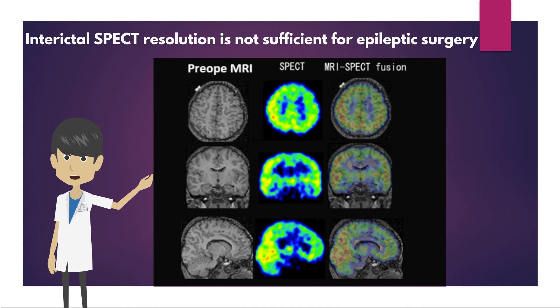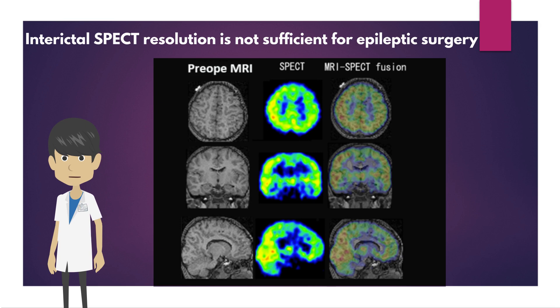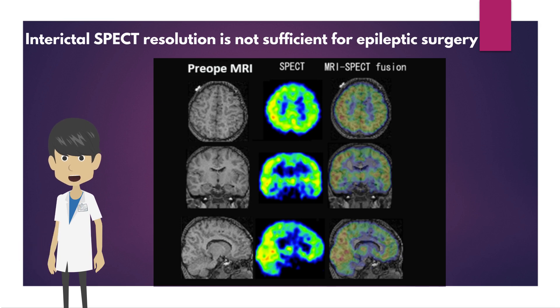Brain perfusion SPECT of the same patient during the interictal phase shows a slight decrease in perfusion around the small cystic lesion on MRI, but less clear than PET due to the low spatial resolution.